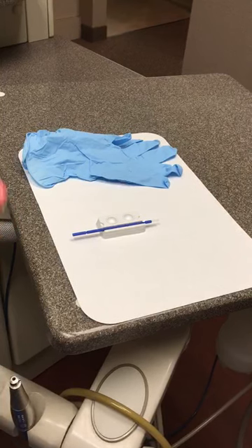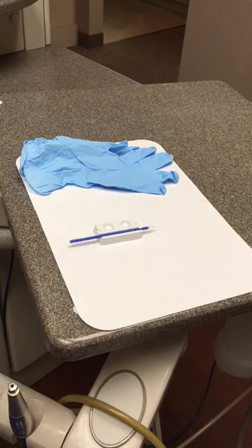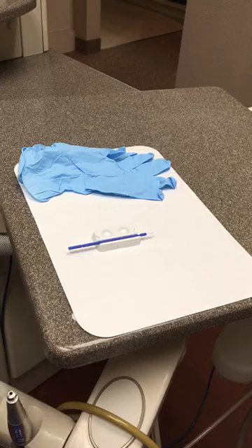You only need one to two drops for site-specific or incomplete dentition, two to three drops for primary, three to four for mixed, and four to five drops for adults.